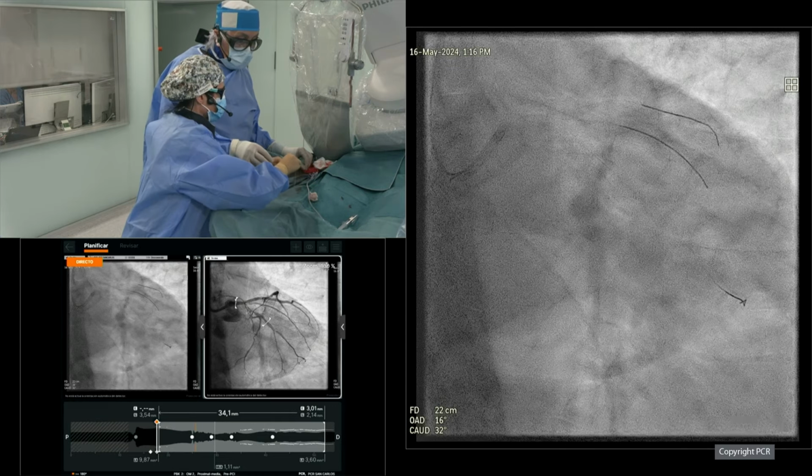But with that, of course, this is also a typical scenario where you see that the balloon is not advancing well. And you have to be very careful because you can distort the stent. When it happens to me, Javier, I ask my fellow, did you place the balloon on the right wire? How do you make sure of this? Well, it's a question for Nieves. Nieves, have a check on the wires. I think I did.